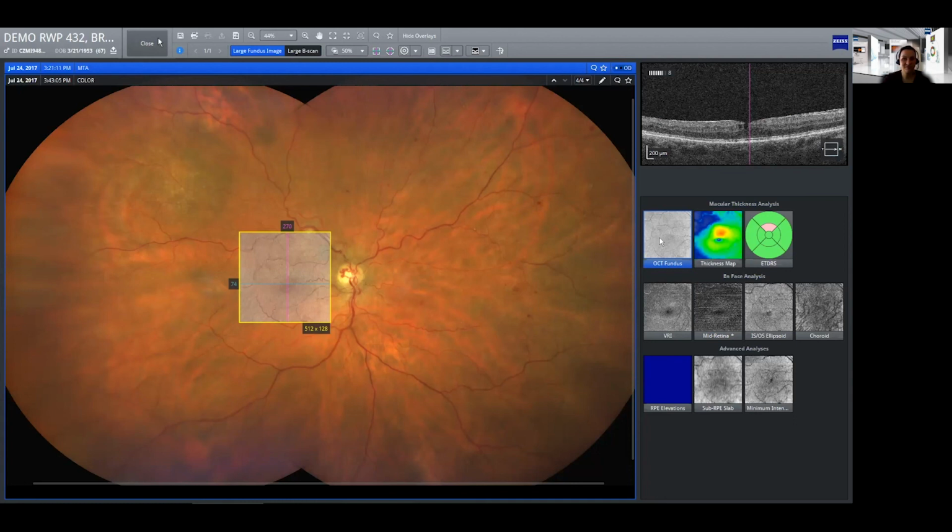Vendors don't share that information amongst each other. That's why this is still a limitation in the market, to see vendors doing thickness analysis and then advanced analyses with data from other vendors, because everybody keeps this very proprietary. Hopefully this may change in the future so that there's more flexibility.